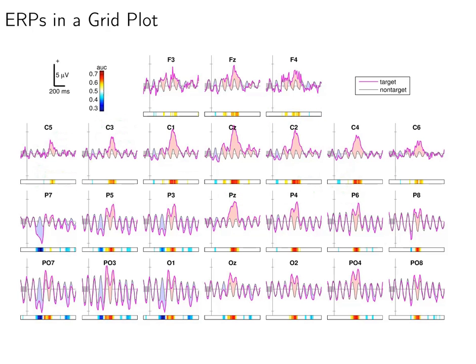One example is the R square metric that we have discussed, a point-wise correlation. When we have less separability, these colors are less visible. Using this kind of separability measure, we can also tell where in time the separability is happening or visible.